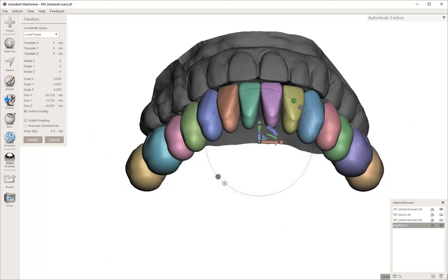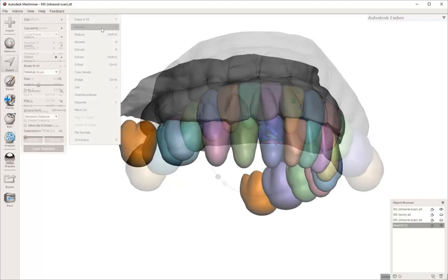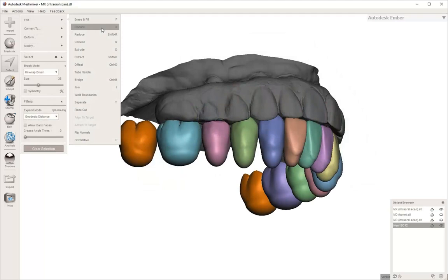You can turn off the mandibular teeth so that they're not getting in the way, and you can start to see that maybe the teeth need to come more lingual. If you look here in the distal, the teeth that came already set included the second molars.